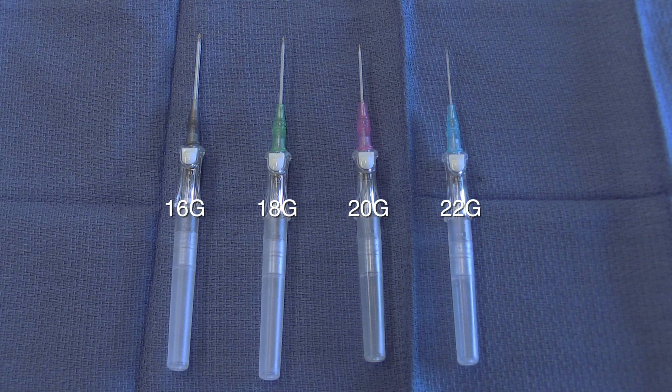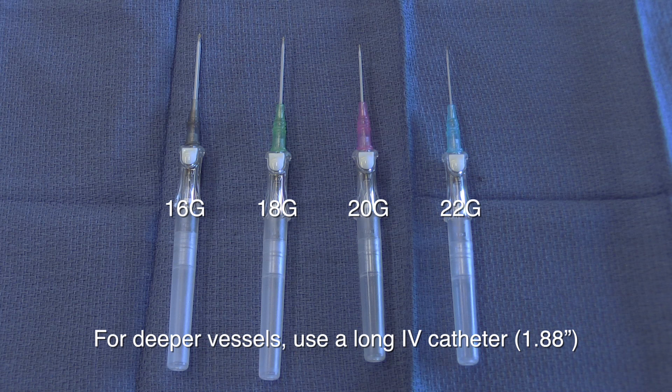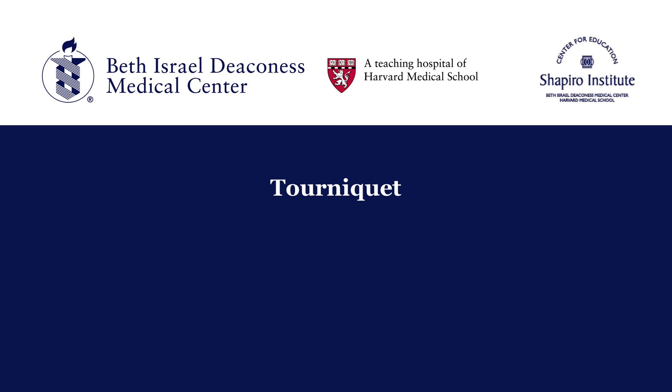Select an appropriate size IV catheter. It can be helpful to insert the largest possible catheter for the vessel size, which can be measured or estimated. Large-bore access can be helpful in a variety of clinical situations.